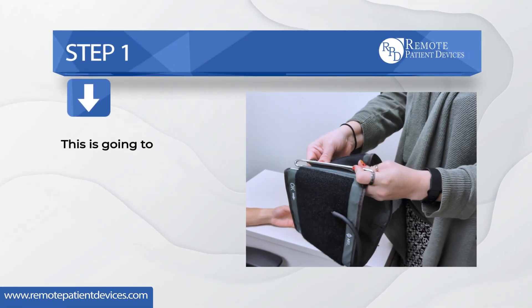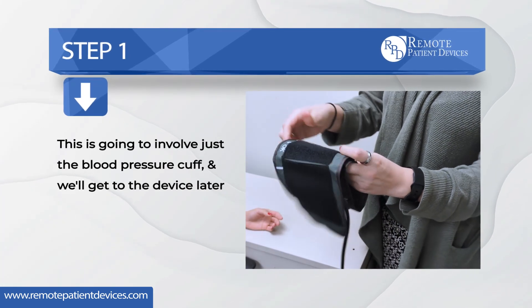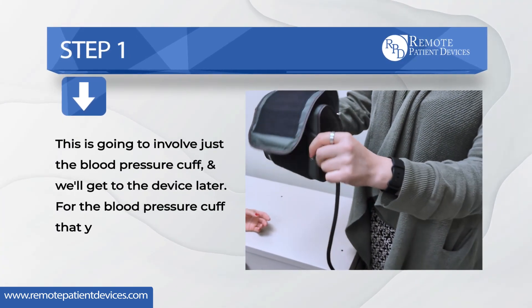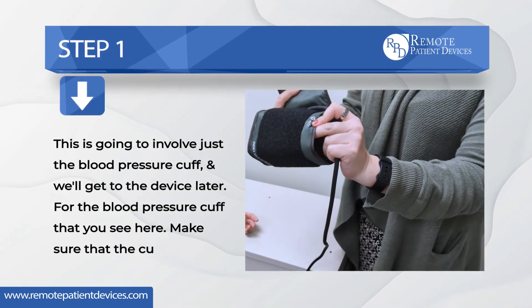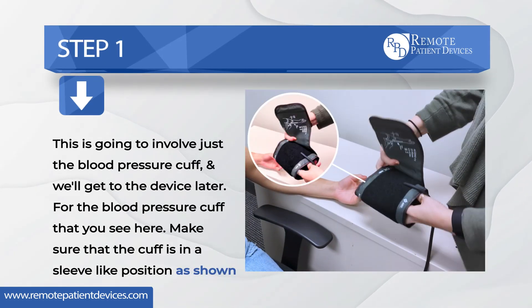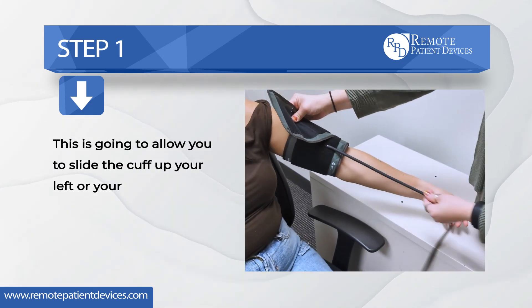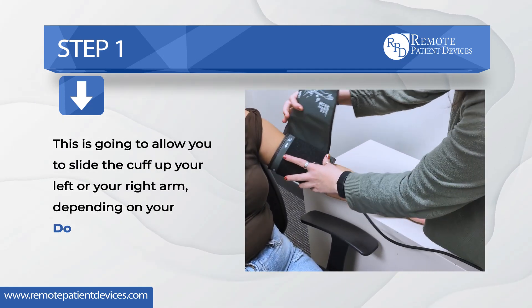Step one — this is going to involve just the blood pressure cuff, and we'll get to the device later. For the blood pressure cuff that you see here, make sure that the cuff is in a sleeve-like position as shown. This is going to allow you to slide the cuff up your left or your right arm depending on your doctor's recommendation.